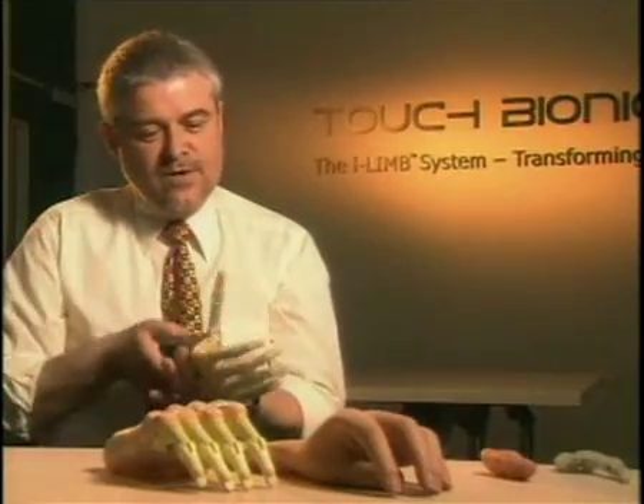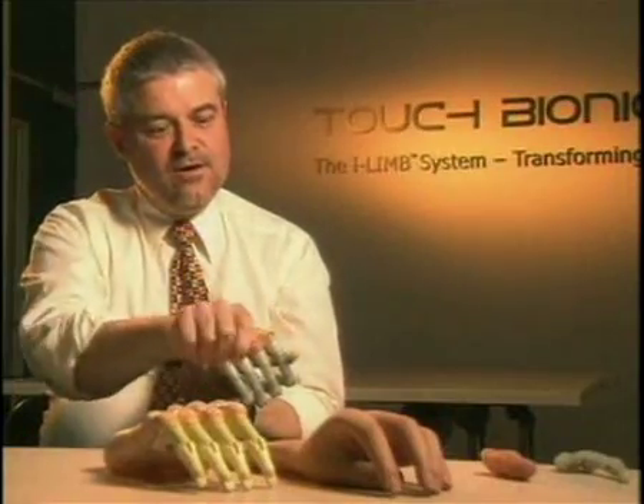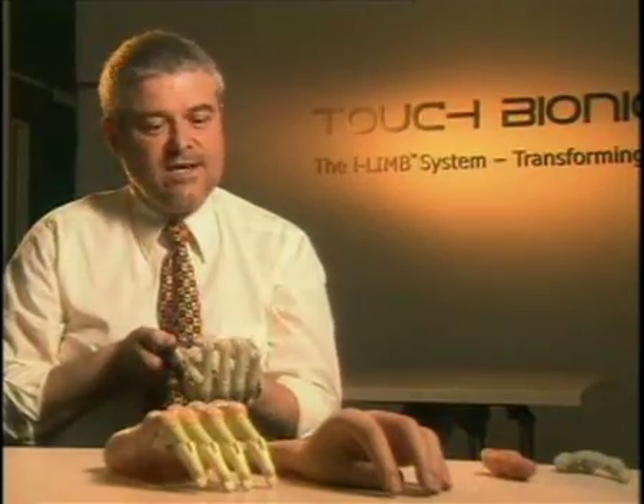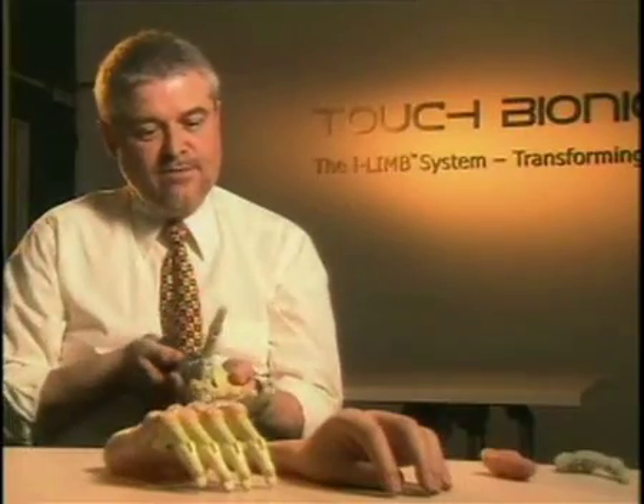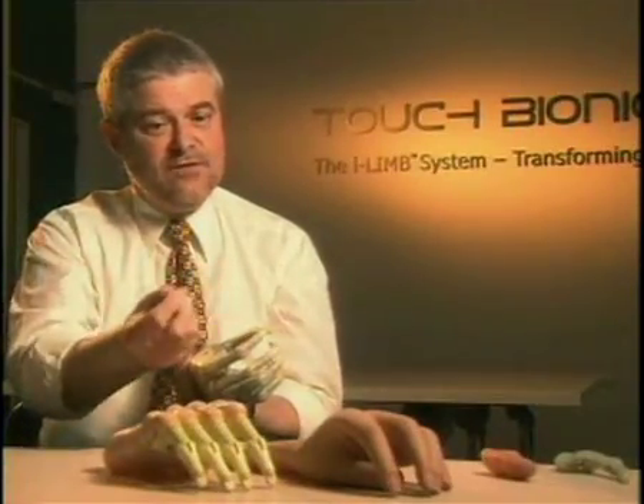We can put this into what we'd call the key grip, which is where — as you'd imagine — you turn a key in a lock. Again, existing electric hands can't do that. And then we can put it into the pincer grip, where the thumb and fingers meet together in a precision grasp to give us a three-point grip.